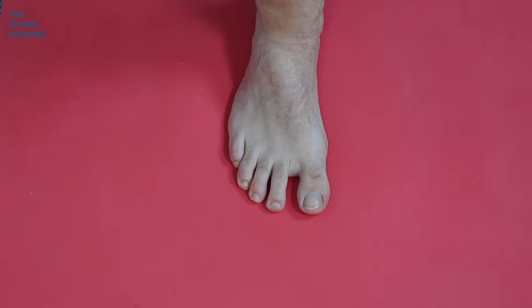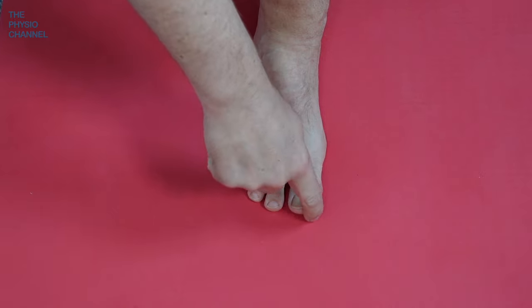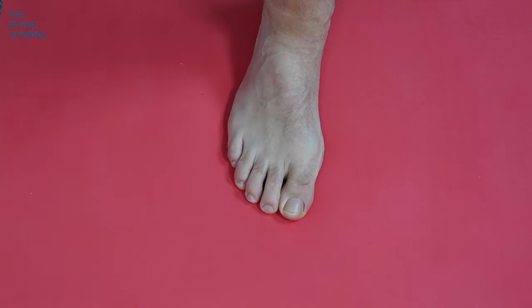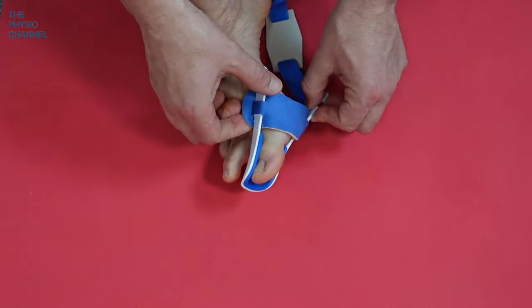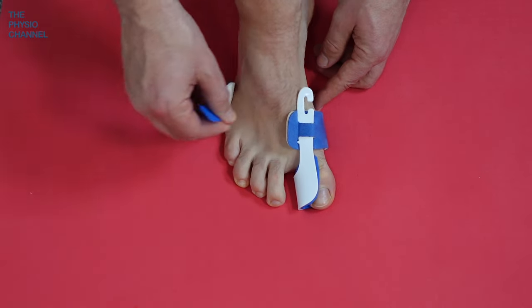I don't have a bunion or hallux valgus, but it's very easy to create an artificial one by pulling my toe across and pressing it into the ground — that would be the start of hallux valgus. So I'm going to show you how to fit this effectively. Pop it over your toe, then it goes around the ball of the foot, and the strap comes around like so.